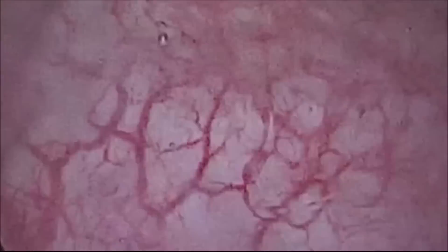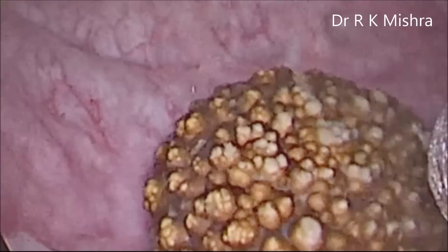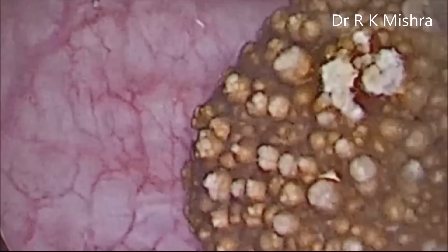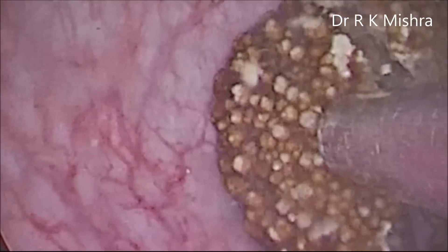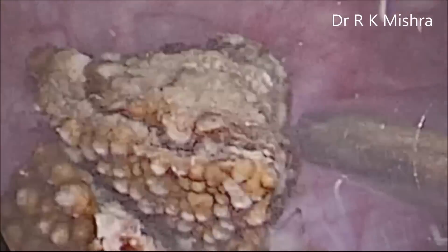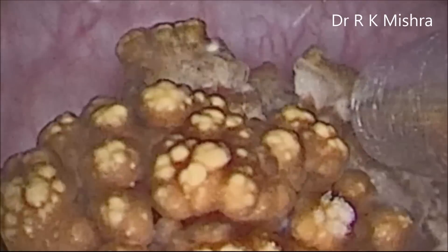This is a simple 2.5 cm bladder stone that is removed by pneumatic lithotripsy. You can break the stone into multiple small pieces. This is a very simple device called pneumatic lithotripsy, and it can take all the stone out by breaking it into small pieces.